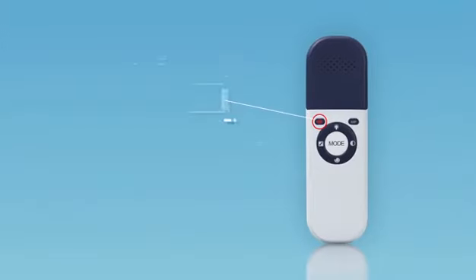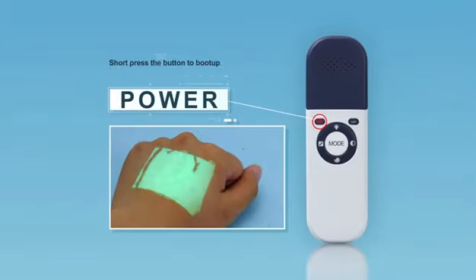To power on VeinFinder, short press the power button. Short press this button again to turn the device off.